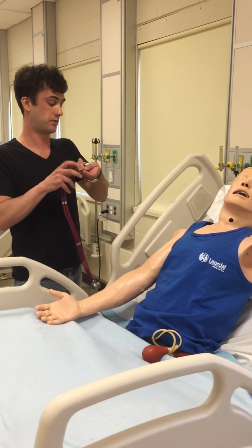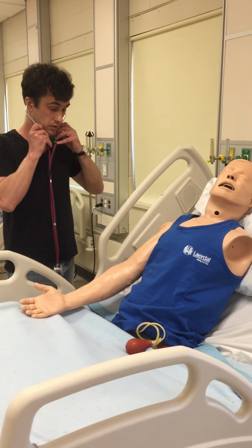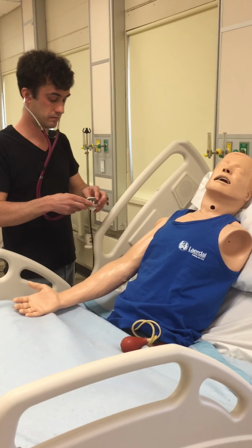At this point, I would listen to the patient's breath sounds using my stethoscope.